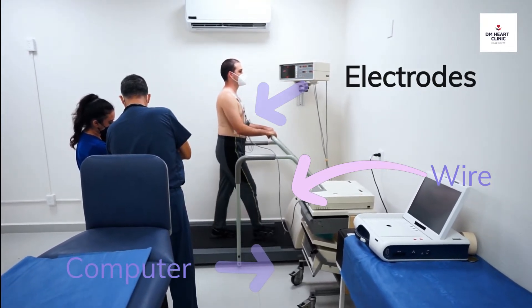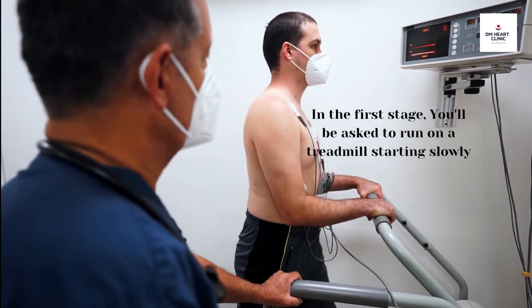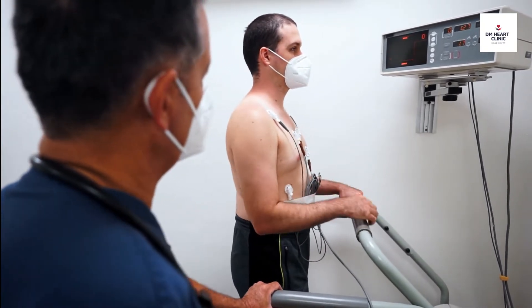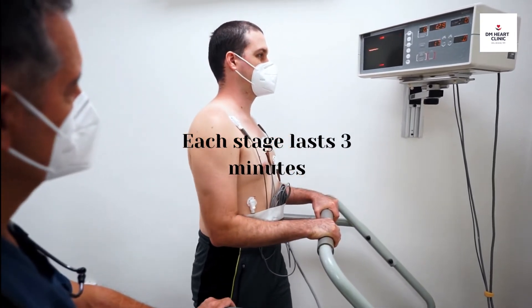When the test begins, you'll be asked to run on a treadmill starting slowly — it is more like simple walking. This is called Stage 1, and it lasts for 3 minutes.